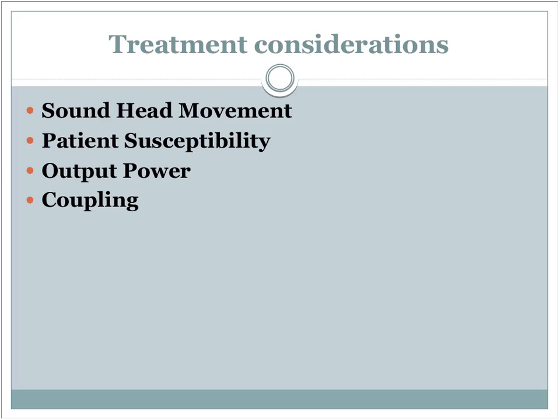Ultrasound is somewhat like electricity. It's going to transmit through the least resistive thing, and that's going to be the gel. And so you may be dispersing a lot of the sound waves throughout the gel. You're not penetrating into the patient. You're not going to get the right effect, okay?